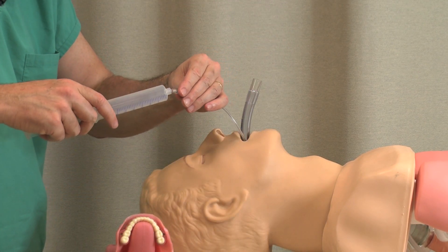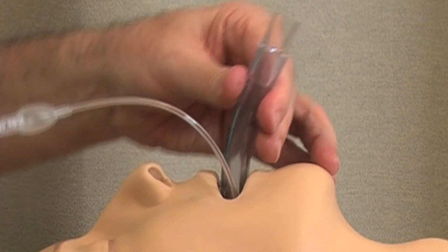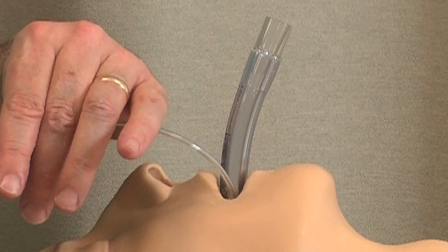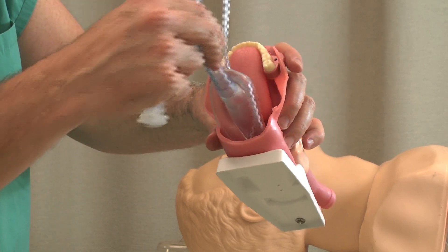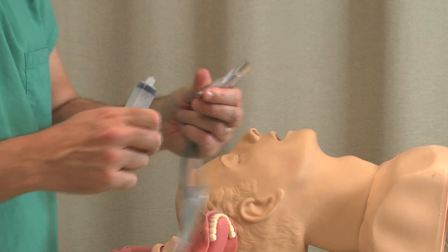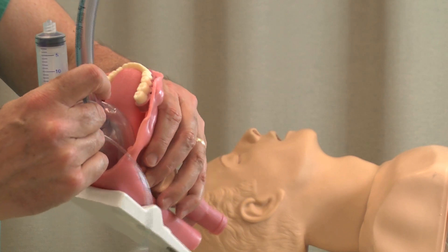Once it's in there, you inflate it. Did you see how it came up a little bit? When you inflate it, it tends to kind of kick up a little bit. I'm going to show you on the larynx exactly where it's fitting — it fits right here, right like this. There are your cords. It fits right like this. And when I inflate it, it forms a less-than-perfect seal around here.